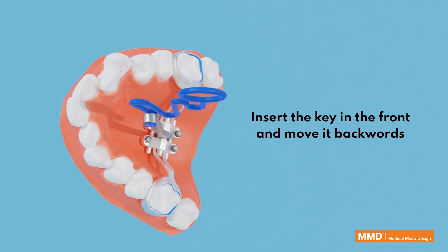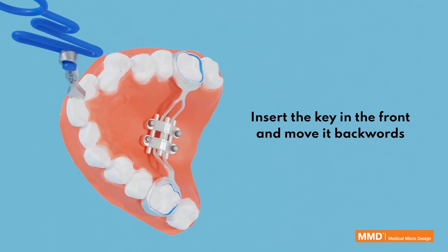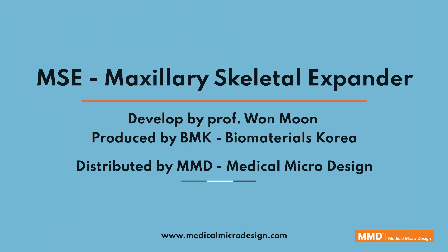Insert the key in the front and move it backwards to activate. The MSE Maxillary Skeletal Expander was developed by Professor One Moon, produced by BMK, and distributed in Italy by MMD.